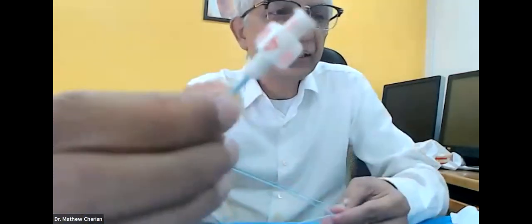The next thing about catheters is the properties of the catheter, in terms of what guidewire can go, what is the length of the catheter, and so forth. For example, this catheter has 4 written on it. What does that mean? It's a 4 French catheter. There are some other statements on it, like 038 is written on it, which means a 038 wire can go on it.